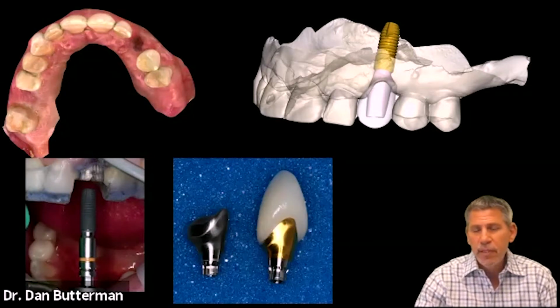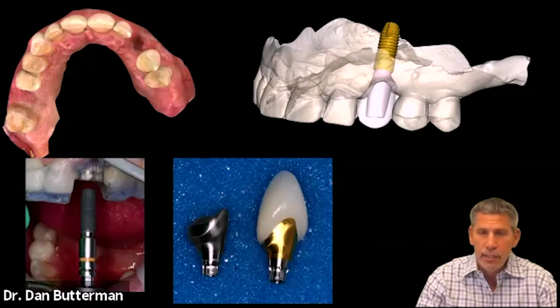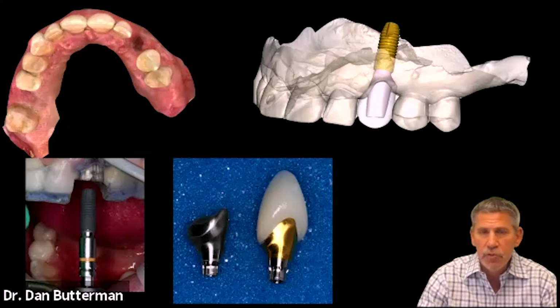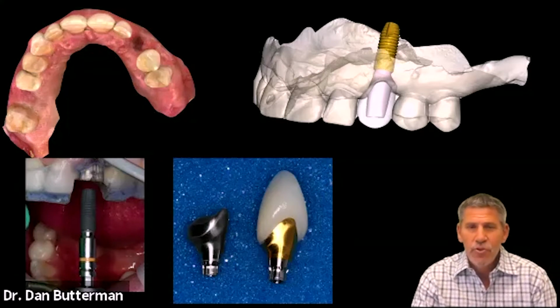And the cool thing about this is, look at the contours of that healing abutment and the final one. They're identical because they're based off the same digital file. So what's the advantage of that? Look at it the way you used to do implant surgery.